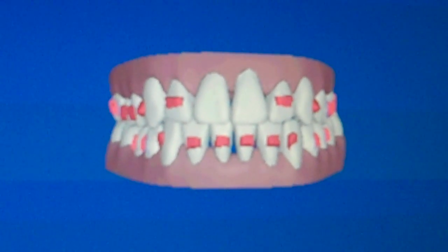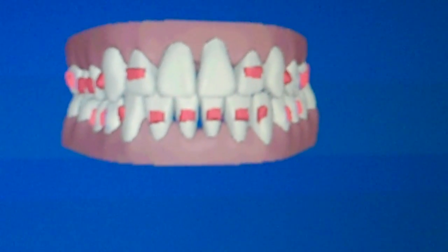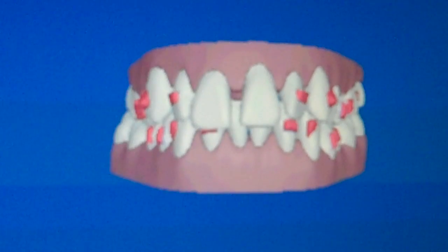Now when you see it jump like that, that means at some point you're going to be wearing rubber bands. From there, I'm going to run it through again.